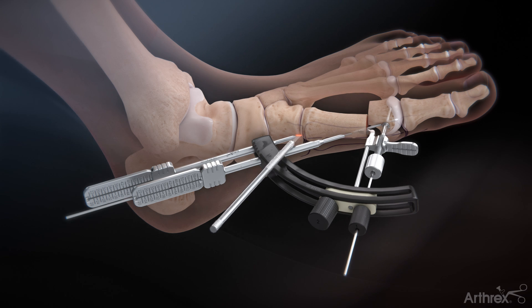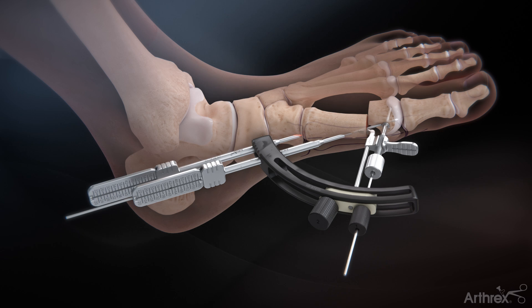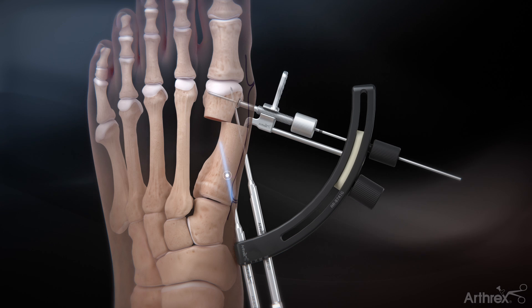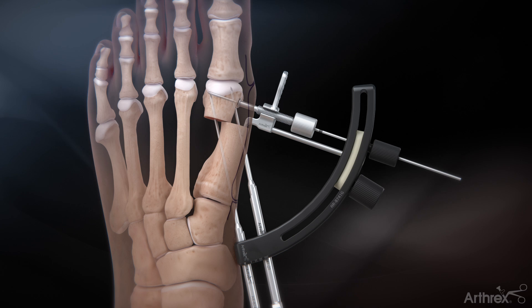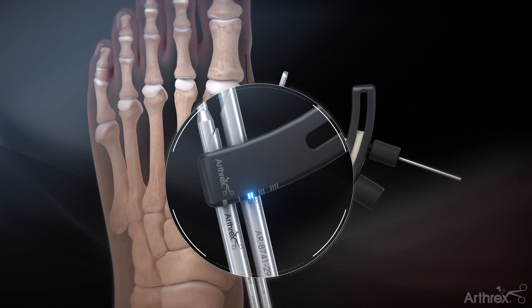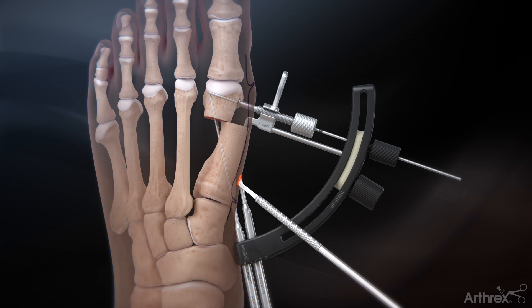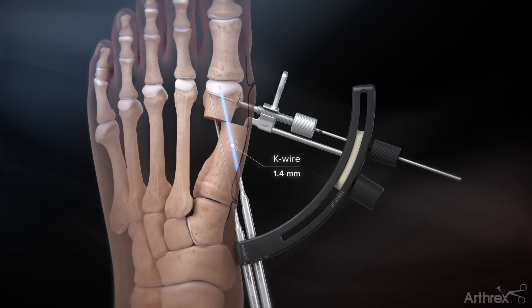Make a stab incision at the site where the proximal K-wire sleeve contacts the skin. Slide the sleeve down to bone, ensuring that the bevel of the sleeve parallels the metatarsal. Advance a K-wire through this sleeve, traversing both cortices before entering the capital fragment. Remove the temporary guide wire and shift the second K-wire sleeve distal to the first, being sure to skip at least one slot. With a stab incision, advance the sleeve down to bone in a similar fashion to the first sleeve. Advance a K-wire through the sleeve for the distal screw placement.